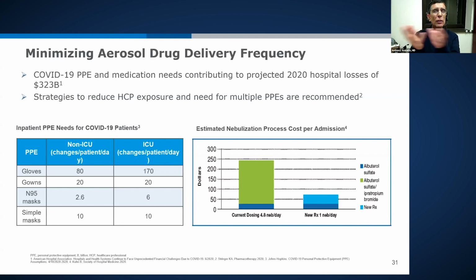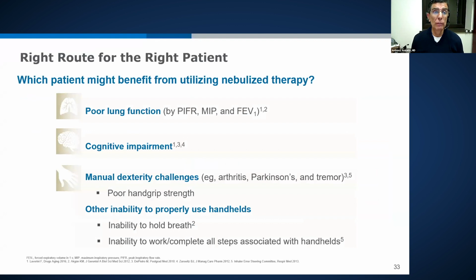We use gel to get in and outside the rooms. This also very significantly facilitates patient care. So it allowed nursing staff and respiratory therapists to enter and give nebulized therapy without any concern. We are now changing our understanding of how to use nebulized therapy.